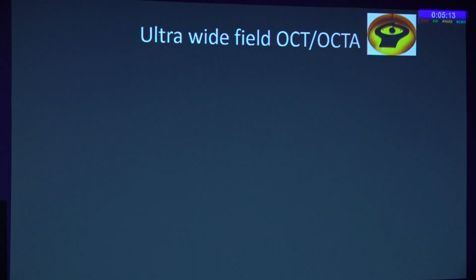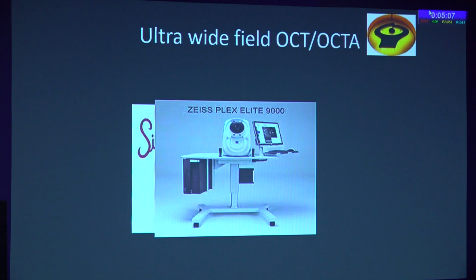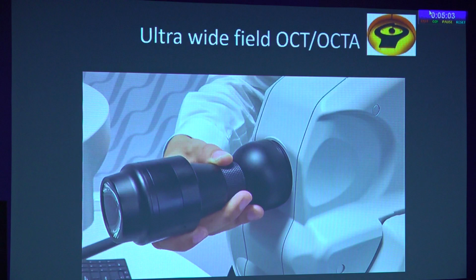And then came the need for ultra wide field OCT, or OCTA, which is now available with the Silverstone swept source, the Zeiss Plex Elite 9000 and the Mirante from Nidek, and they all need an extra lens to capture the ultra wide field imaging.